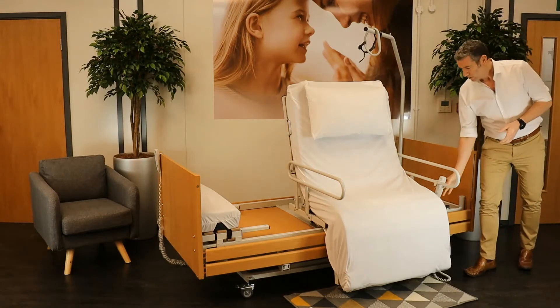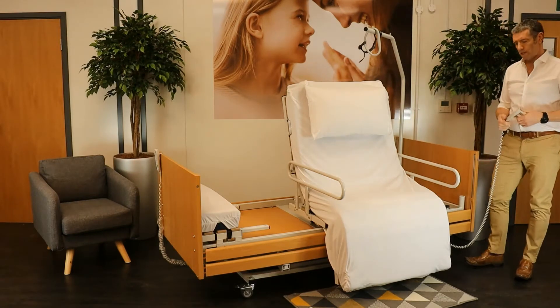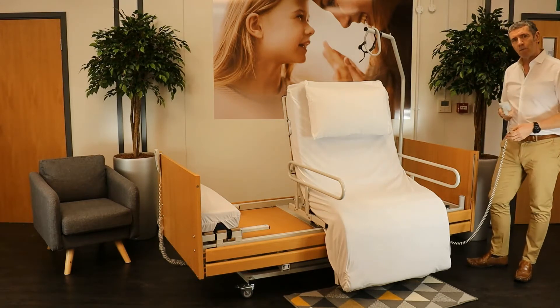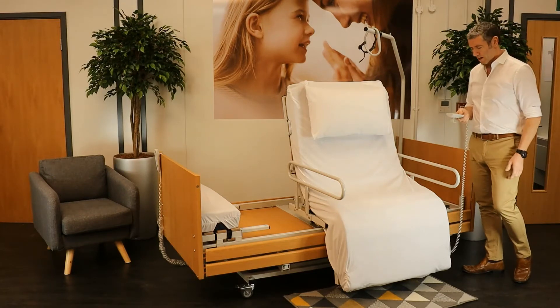The Rotopro Rotational Chair Bed enables you to do this through a user hand control that you can see here. As you can see, the bed at the moment is in a seated position, so you would enter the bed to sit in there.